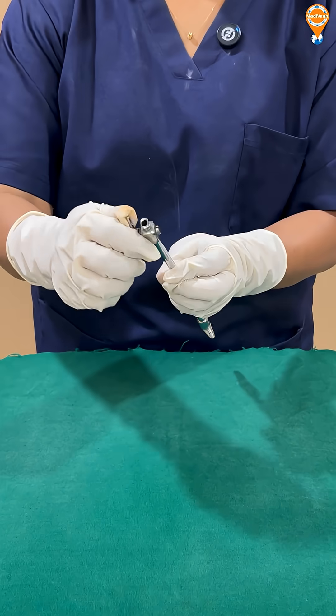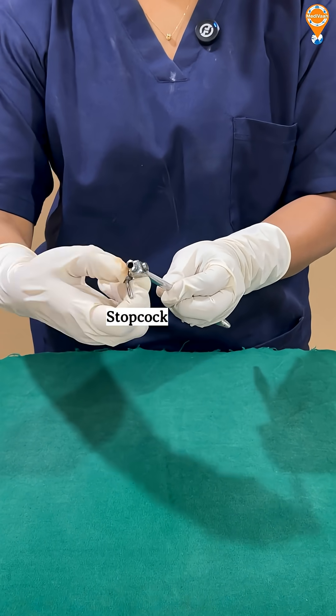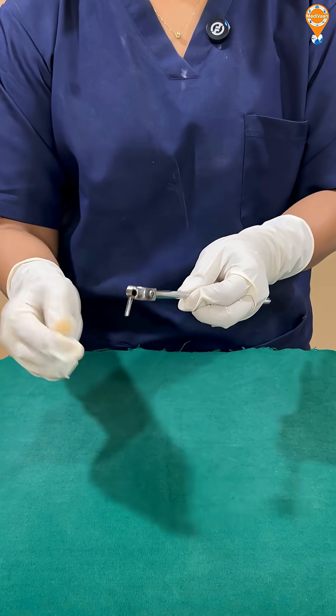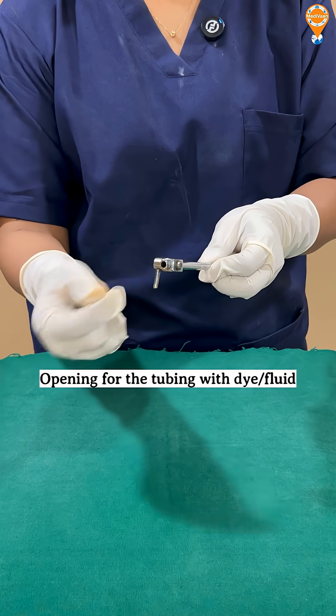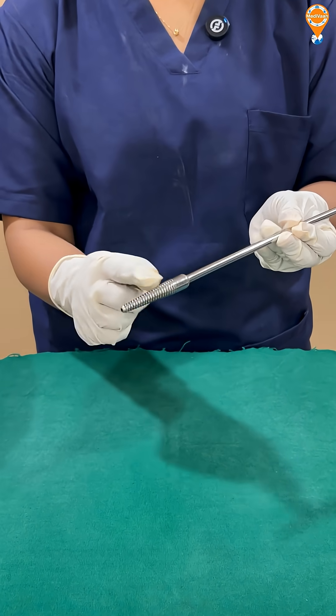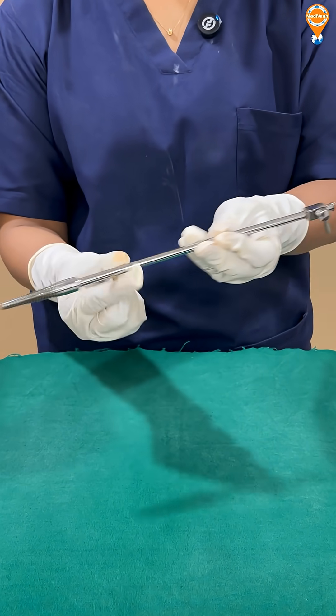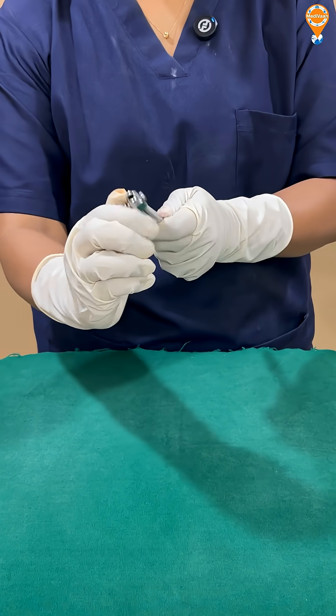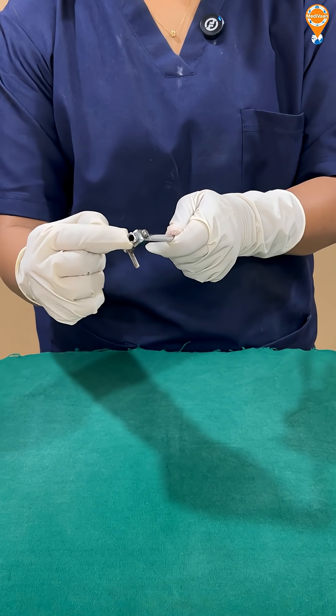We have got a stopcock. This stopcock will help us to calibrate the dye or lavage fluid, whatever we are using, and there is an opening to fix the tubing to introduce the dye. So to recap: conical-shaped tip, handle, flange, stopcock, and a connecting tube.